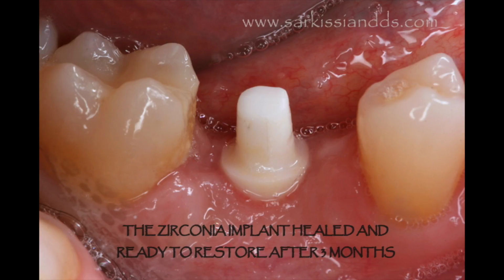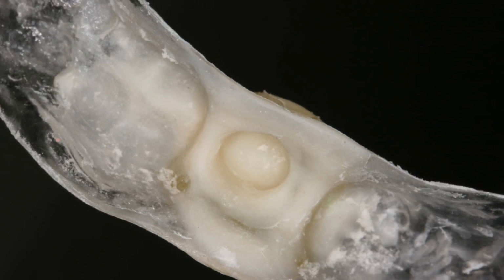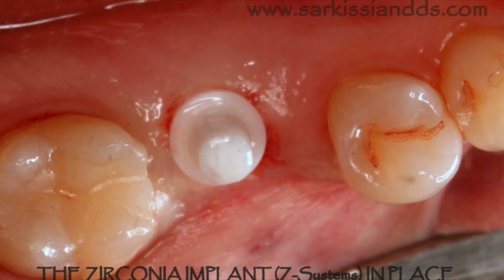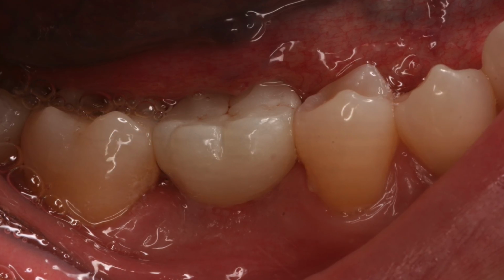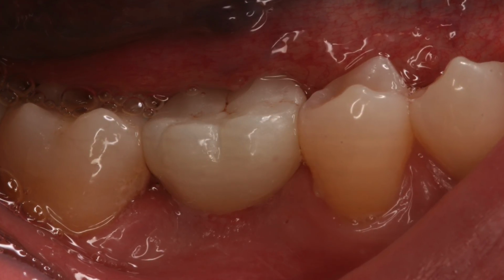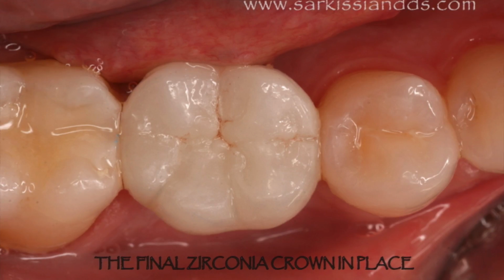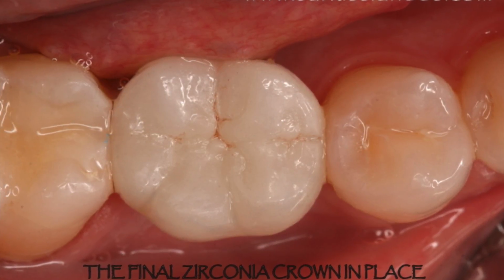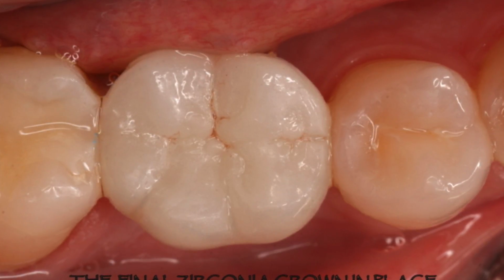The patient in the meantime has to wear a protective appliance to protect the implant while it's integrating. The implant is all ready to restore. We treat it just like a tooth stub. We shape it, take an impression, and order the crown. In a few weeks, the crown, which is also made of a completely metal-free material, in this case zirconia, is cemented, and voila, the patient can go home happily with a full set of teeth.